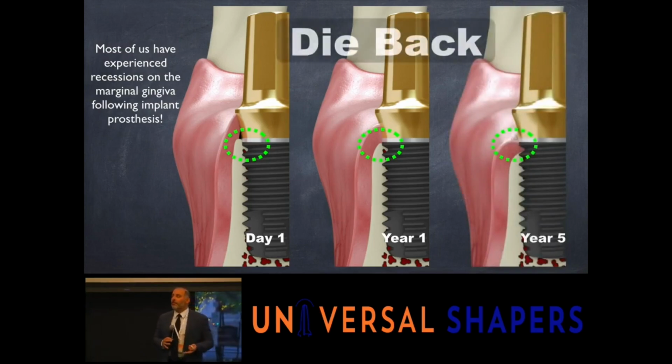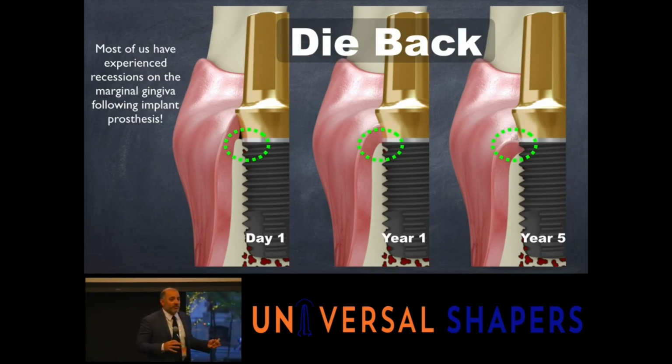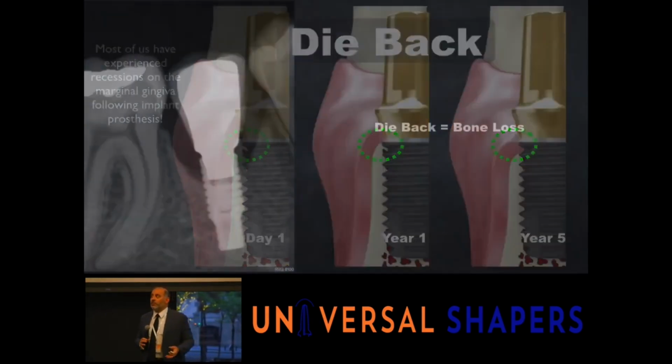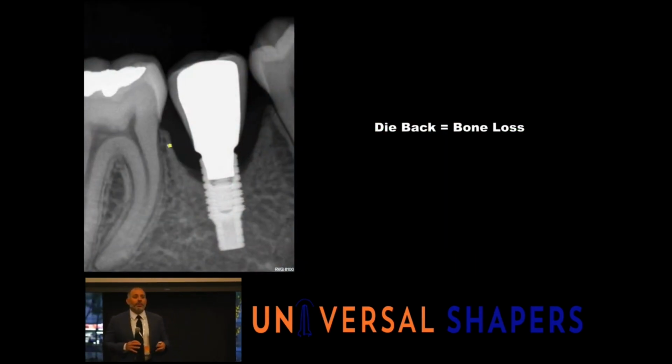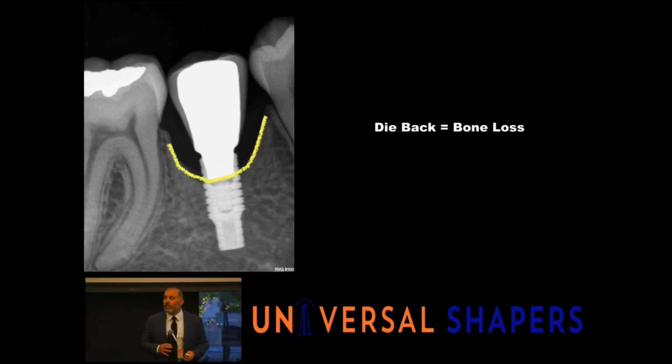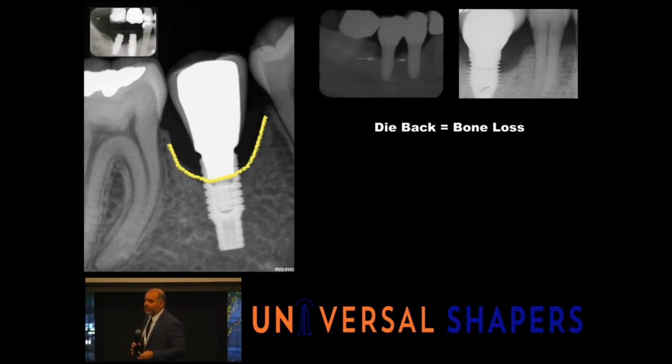I'm not telling you anything you don't know. But for years, we were having this scenario which we like to term affectionately dieback. I don't know why we came up with this name dieback. The bone dies back. That's bone loss. It's not dieback, it's bone loss. So to me, dieback is equal to bone loss. We end up with these scenarios where we lose bone around the neck of the implant, it shrinks back, and we have a crater defect.